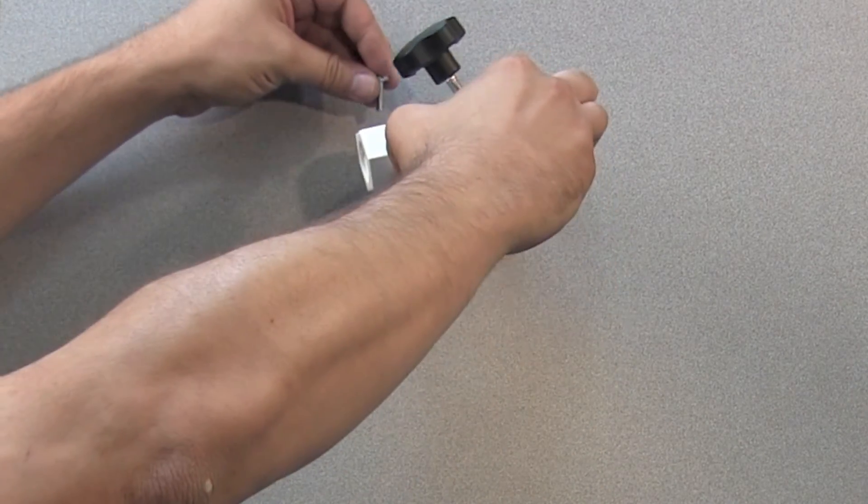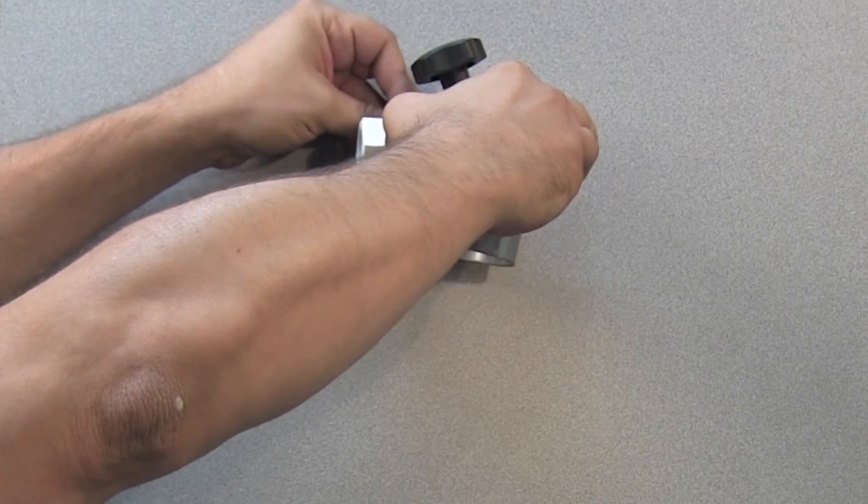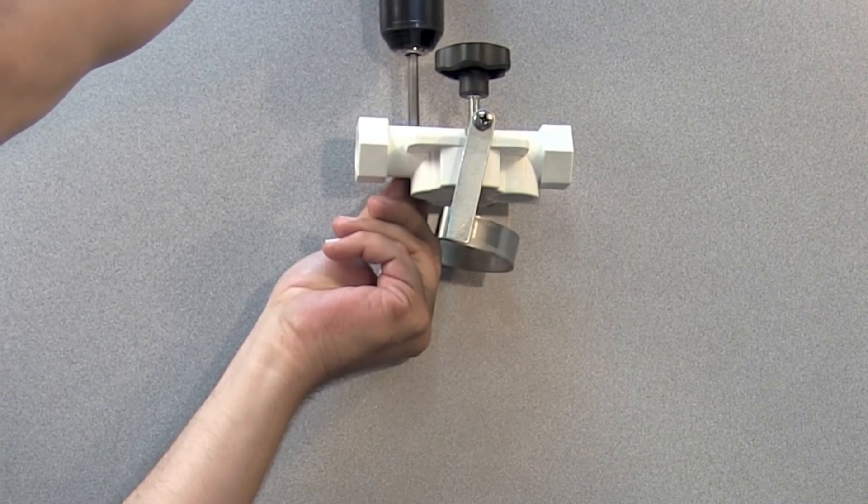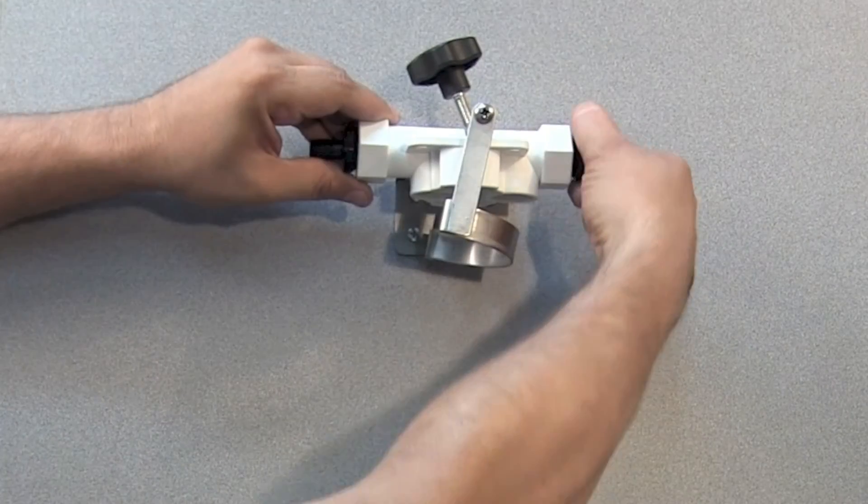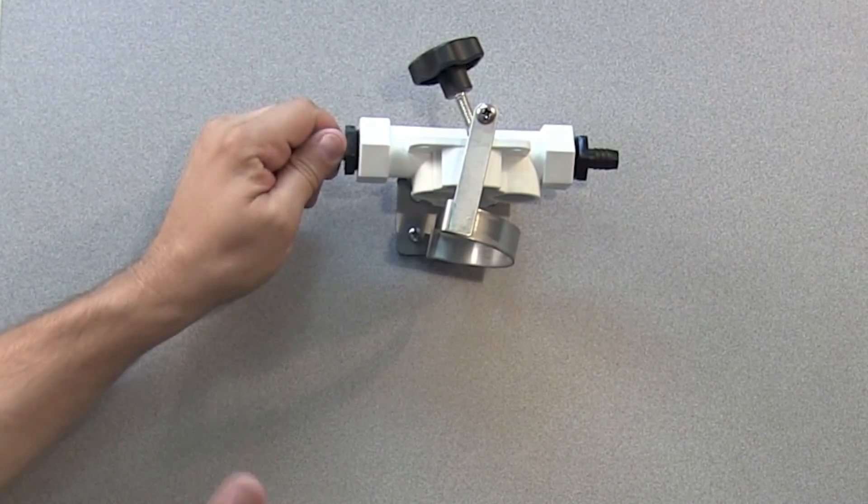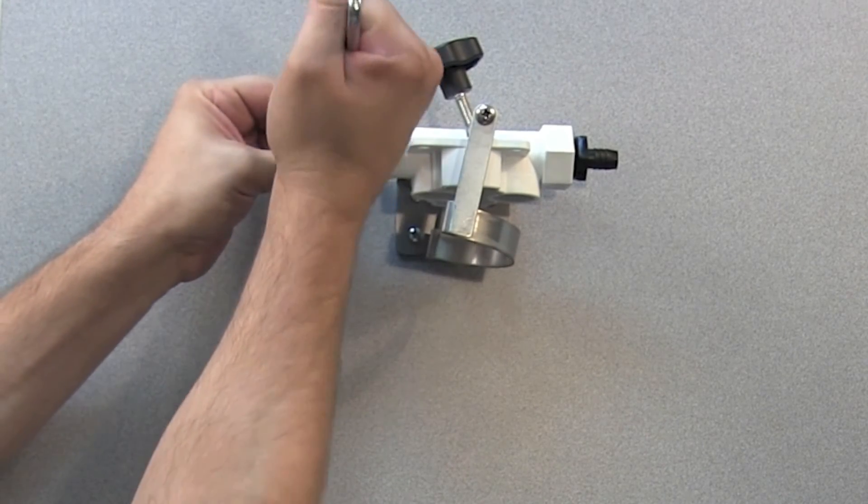Go ahead and mount the manifold with the provided hardware. Because we're installing into flexible vacuum tubing, we'll use the provided tubing barb adapters to connect the tubing we spliced earlier.